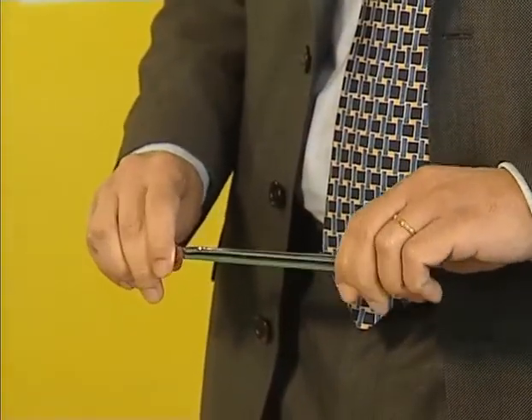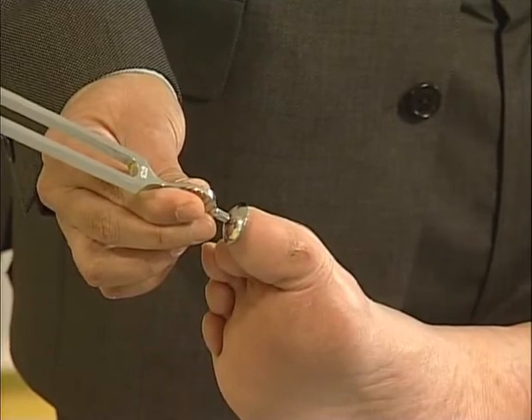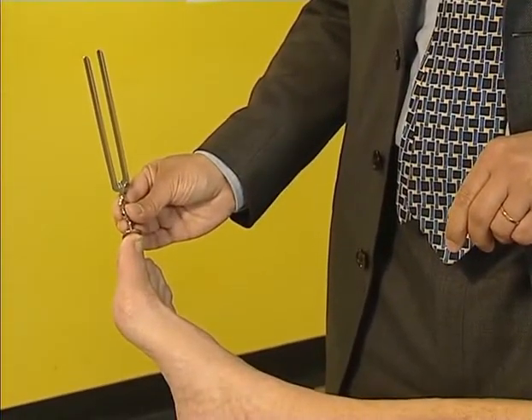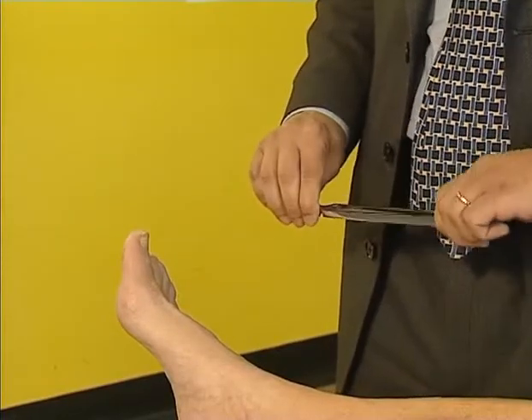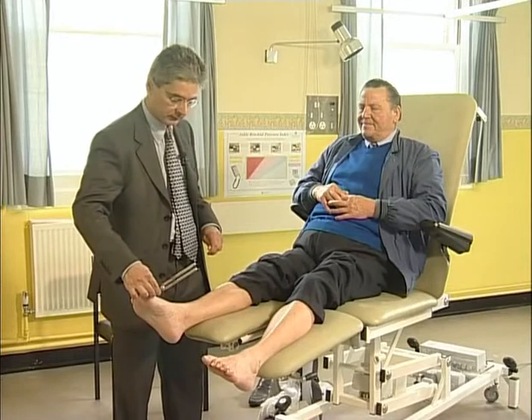Vibration perception will now be tested using a tuning fork. The limbs of the tuning fork are squeezed together, quickly released, and then placed over the big toe. The patient describes what they feel, such as pressure, cold sensation, or vibration. It is important to recognize that vibration perception can decrease with age.